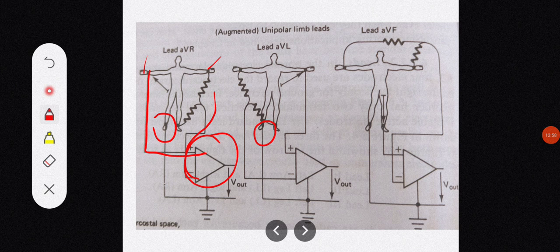So in unipolar electrode, the electrocardiogram is recorded between a single exploratory electrode and the central terminal, which has the potential corresponding to the center of the body. This central terminal is obtained by connecting the 3 active limb electrodes together through resistors of equal size. Initially, the summation used to be taken from the 3 electrodes only.